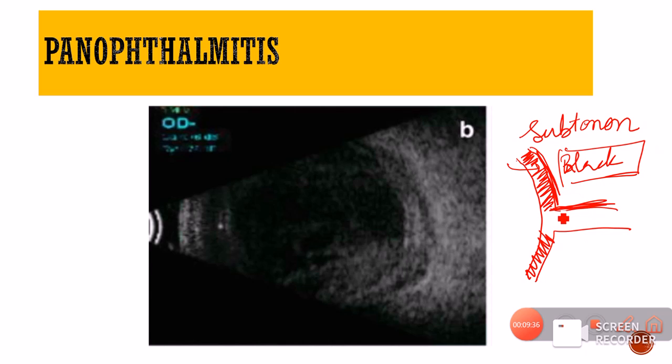And moreover, over here we have the echolucent optic nerve shadow, which is already present. So all these three echolucent structures will make it look like a T, as if a T is written, right? This is called the T sign, and this indicates that there is involvement of the posterior part of the coats, the posterior coats are also involved.